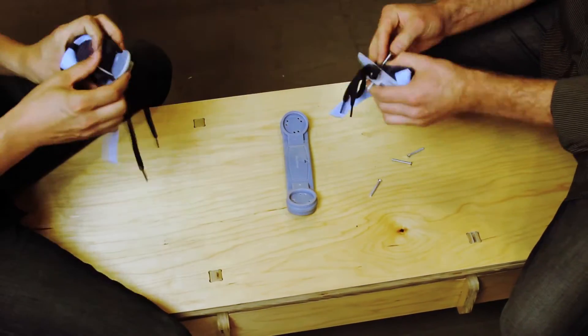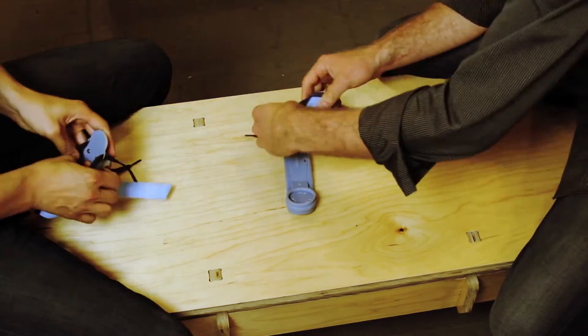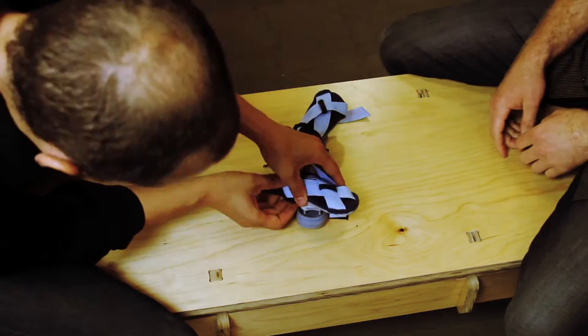When we're designing, we can't just think about putting these things together in a workshop. We have to think about being out in some village where there are no tools. How are you going to put this together? What do they have accessible? So that has to be a part of the design process.